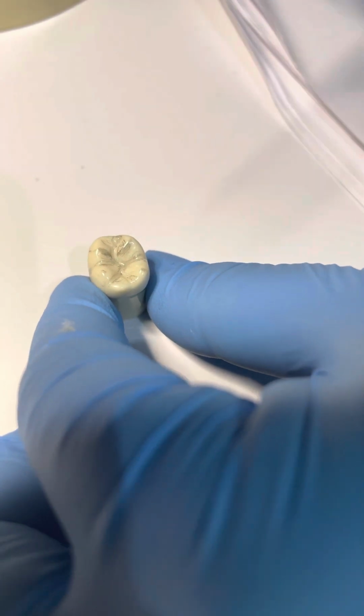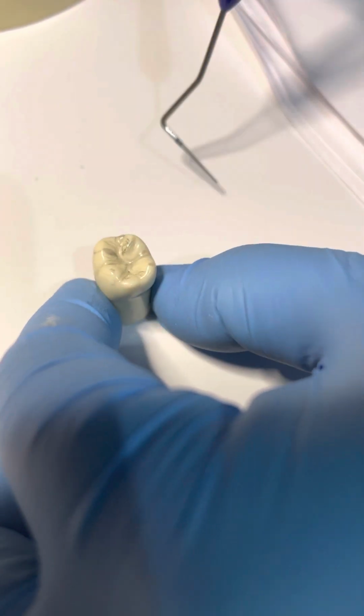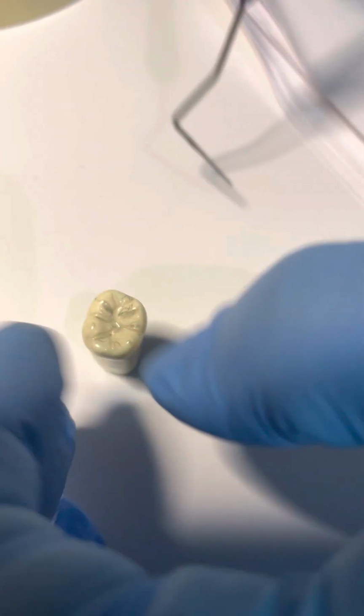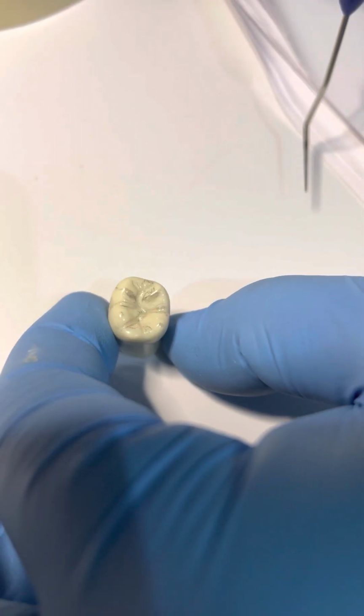Then we have to make sure of the contact point, the positioning and the width of the contact, and the tightness and looseness of the contact, right?